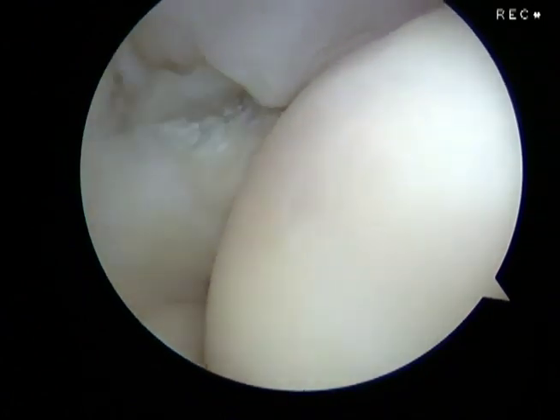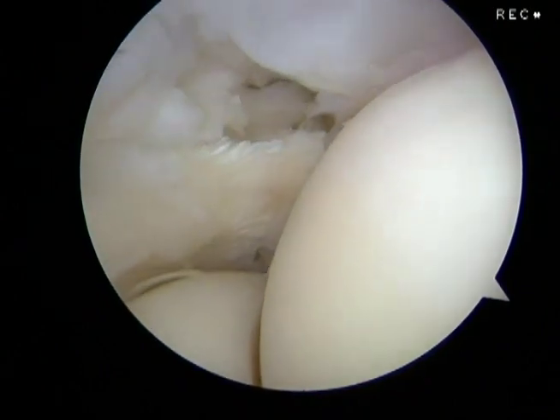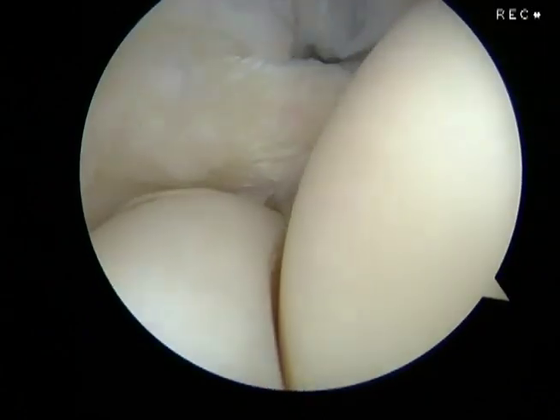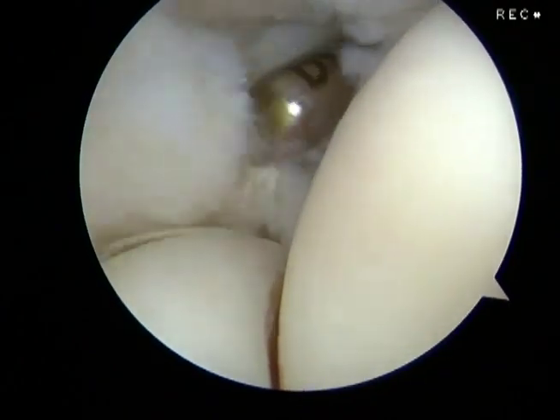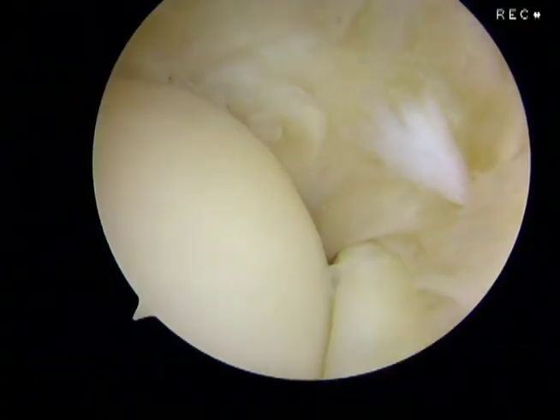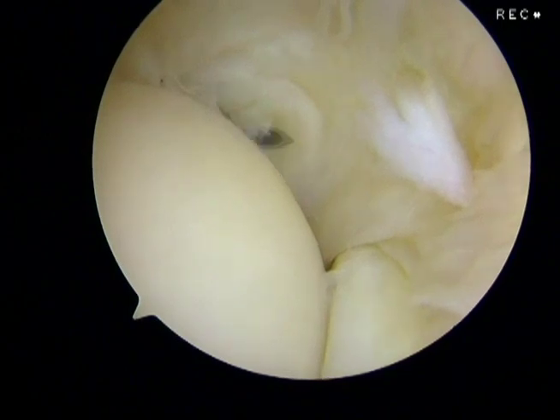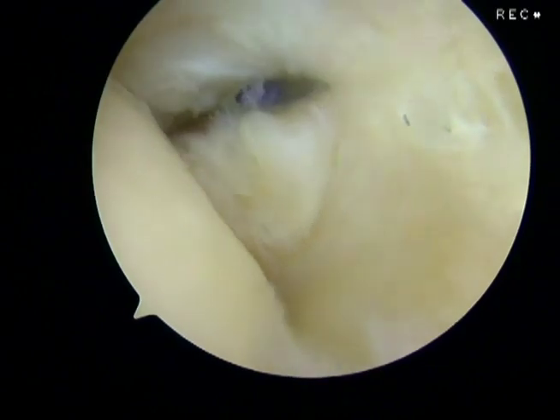Even though the capsule was intact in this patient, notice the degenerated ECRB tendon that's characteristic of patients with lateral epicondylitis. In arthroscopic lateral epicondylitis release, a shaver is advanced into this area and this diseased tissue is debrided away, as shown. In this second example, this time a right elbow, note that the capsule is disrupted but not completely so. This represents a type 2 Baker lesion.